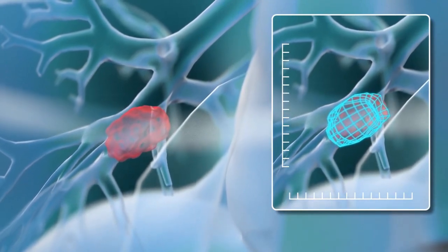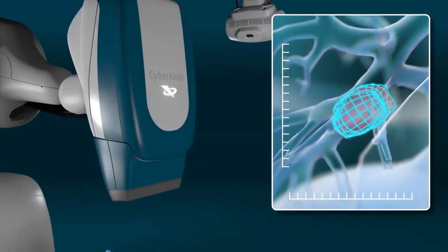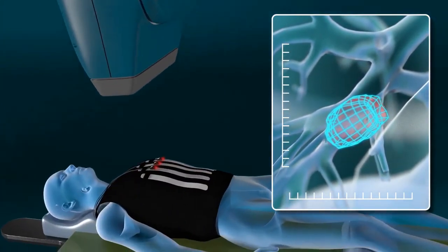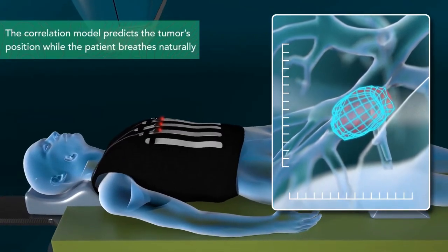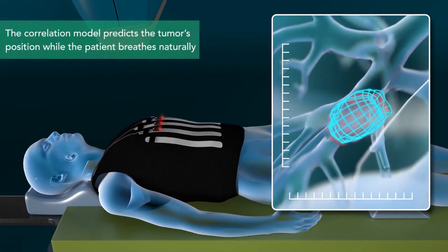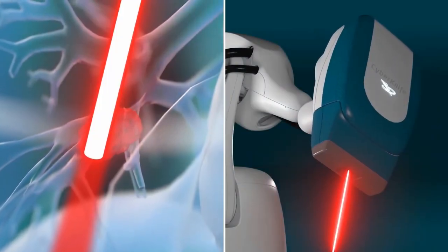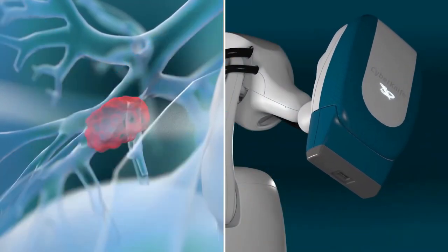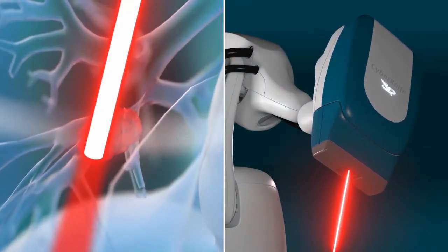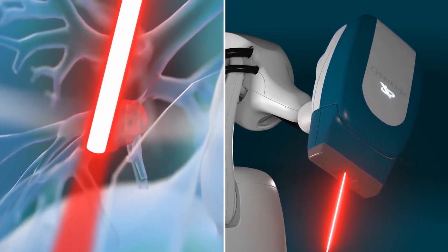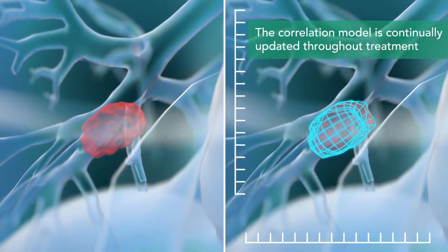The CyberKnife system is a non-invasive treatment for cancerous and non-cancerous tumors and other conditions where radiation therapy is indicated. It is used to treat conditions throughout the body, including the prostate, lung, brain, spine, head and neck, liver, pancreas, and kidney, and can be an alternative to surgery or for patients who have inoperable or surgically complex tumors.